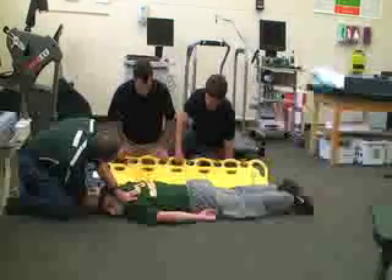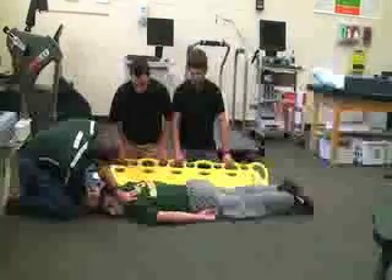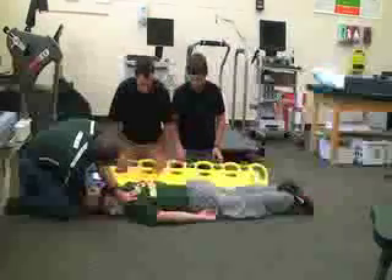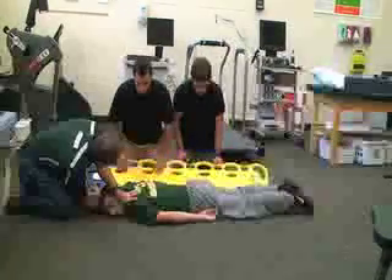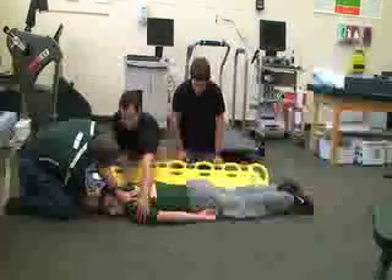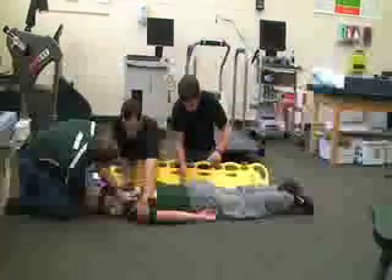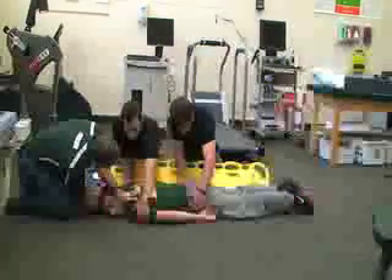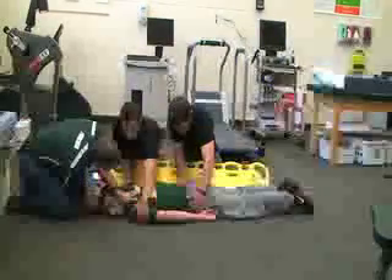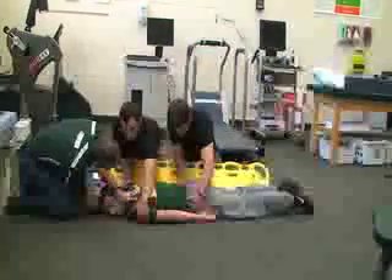They've angled the backboard at about a 45-degree angle. It's very important that you maintain alignment and you're all doing this in sync when you roll the victim — try to move them as a unit. Rescuer two at the shoulders will place his hands on the shoulders, and rescuer three will place his hands on the hips. On the count of three we're going to turn them onto the backboard: ready, one, two, three.